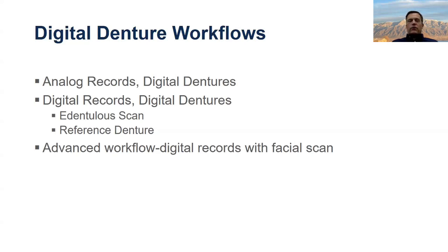I would say a reference denture workflow is probably the best digital denture workflow in 2024. Statistically, 80% of your edentulous patients have some kind of denture that will fit in their mouth. So if you can get them to bring that to their records appointment and you do an impression reline, a bite over it, and some photos, we can get right to a try-in as the second stage.